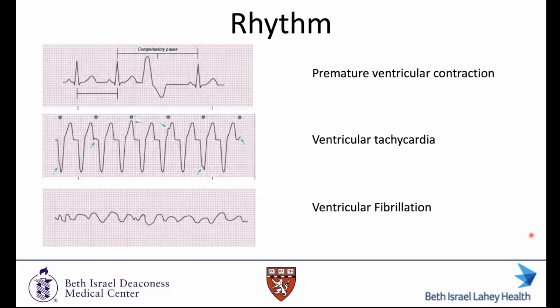Well, that's what the atria are doing, and then it's figuring out in turn what the ventricles are doing. There are plenty of wacky cases we've seen in the CCU and otherwise where a patient could be in AF and VTAC. So I think it's just breaking that down, and we'll do more of that in this session and in future sessions as well to get some practice.